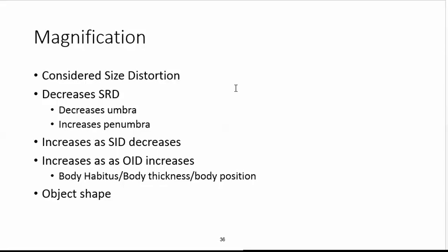And it is often, I find, helpful to use light and shadows to understand magnification, penumbra, distortion, sharpness, and geometric factors. So if you can, turn off the lights in the room, get a flashlight, get a couple of different flashlights if at all possible, preferably one that has light emitted from a fairly large linear array of light bulbs, like fluorescent light, and one that's an incandescent light with a very small spot where all the light comes from. So if you're looking at your shadows, what you'll find is that anything that increases magnification is also going to increase the penumbra and reduce the umbra.